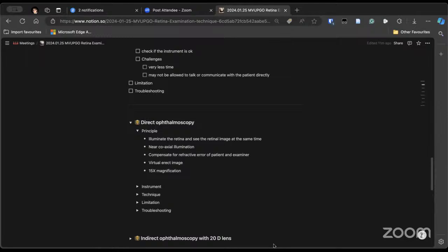And also, if there is bilateral hyperopia, the glow is different. And if there is bilateral high myopia, the glow is different. Try to examine this; even with an indirect ophthalmoscope, you can see the glow. The arc of the reflex will be different in myopia and hyperopia.